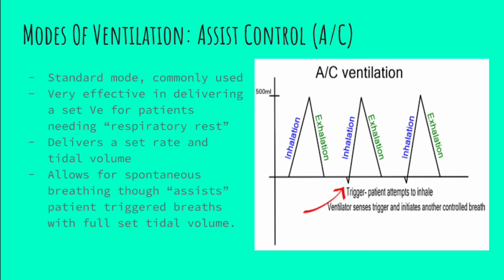So some of the cons with this is this could be one of those situations where breath stacking could be an issue. If you've got a patient who takes a breath and then there's a scheduled breath immediately after the breath that they took and they don't have enough time to exhale, then they're basically going to get two breaths stacked on top of each other. And this could be really uncomfortable for the patient, and this could cause some serious lung injury. But all in all, this mode of ventilation is most commonly seen, and it's completely appropriate in our setting as well as the ICU.